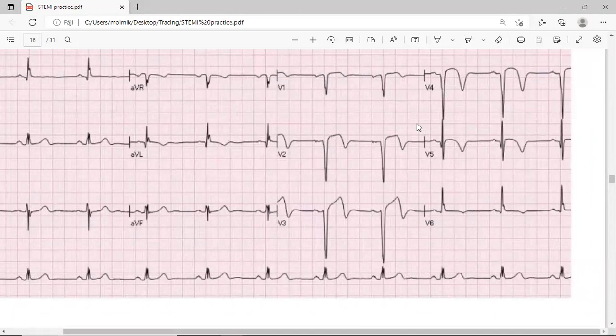So it's MI. Anterior acute MI. That's it. Yes, sir. Okay. Good. Very good. Thank you.